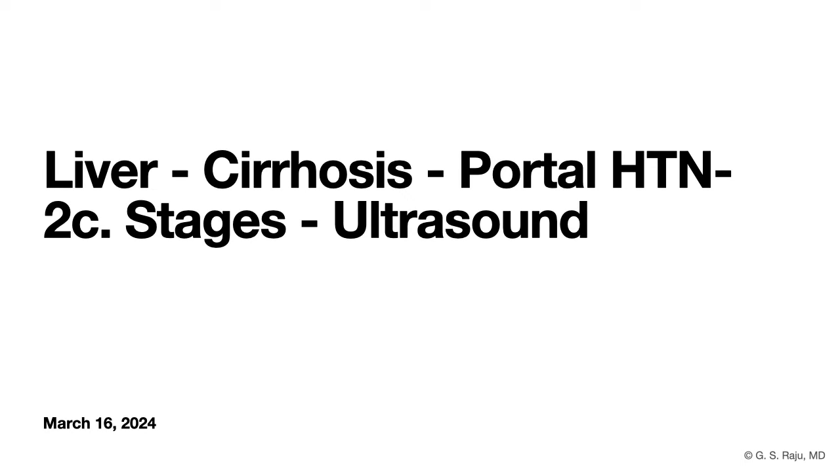Greetings. Let us learn about the role of ultrasound in patients with cirrhosis and portal hypertension.